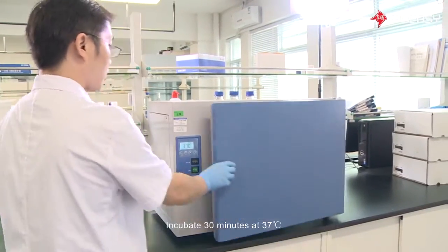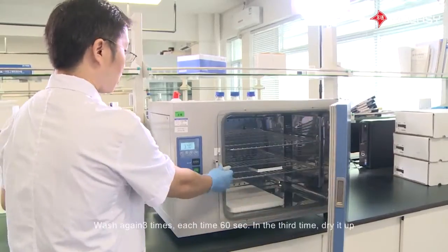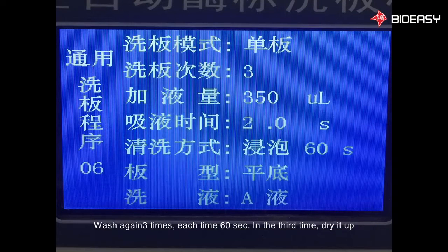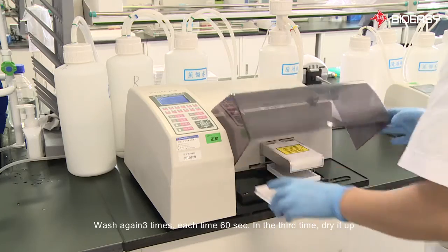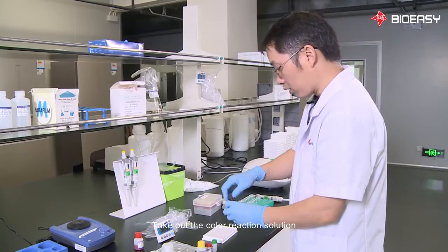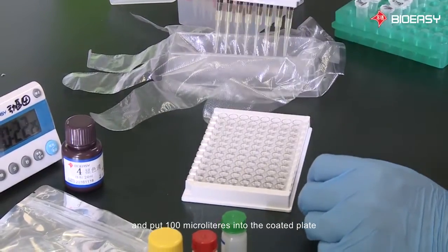Incubate for 30 minutes at 37 degrees Celsius. Then wash again three times, each time for 60 seconds, and on the third time dry it up. Take out the color reaction solution and add 100 microliters into the coated plate.